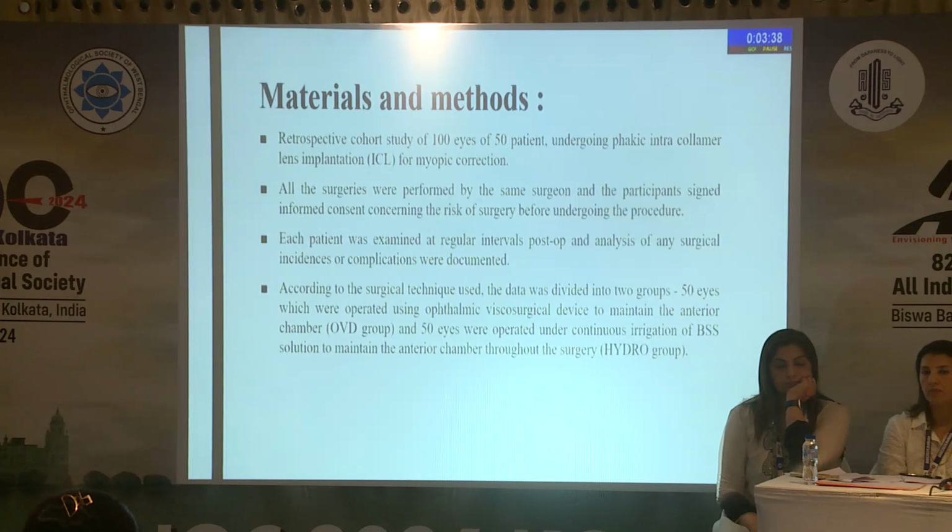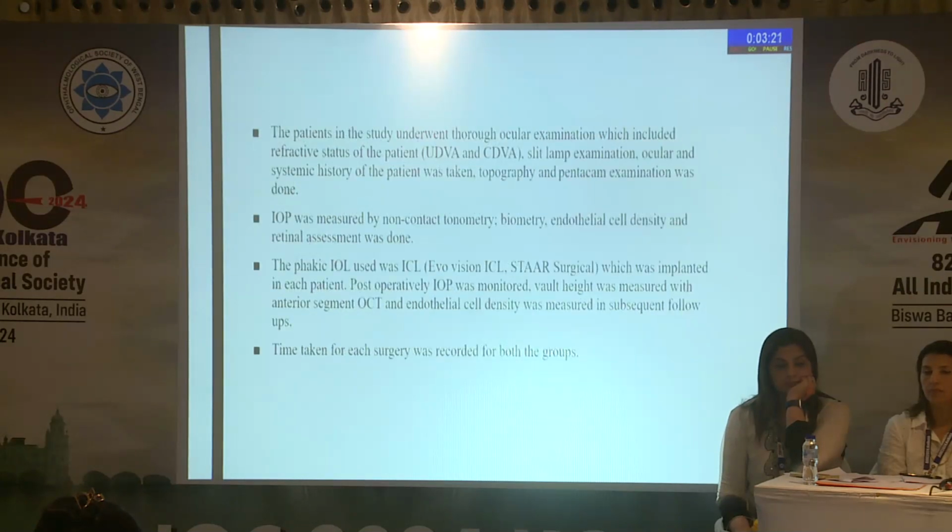This was a retrospective cohort study of 100 eyes of 50 patients. All the surgeries were done by a single surgeon. The follow-up periods were on the first day, 15th day, then 3 months and 6 months. Each group had 50 eyes of 25 patients.